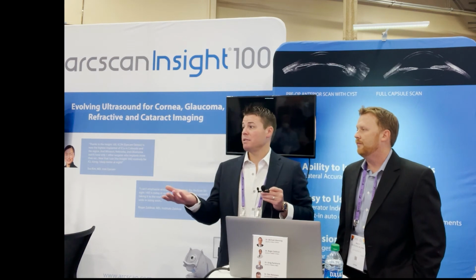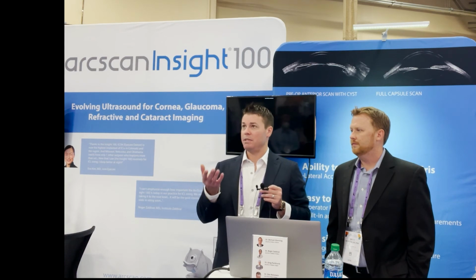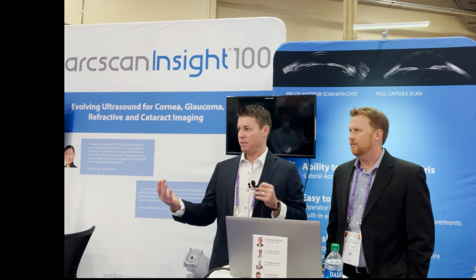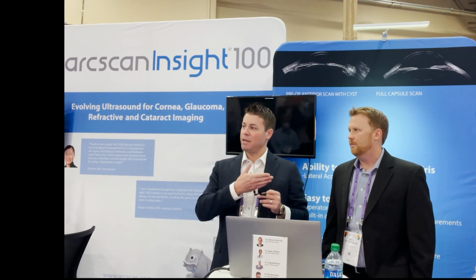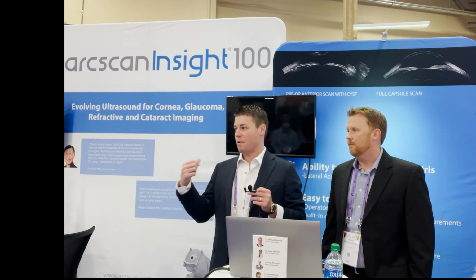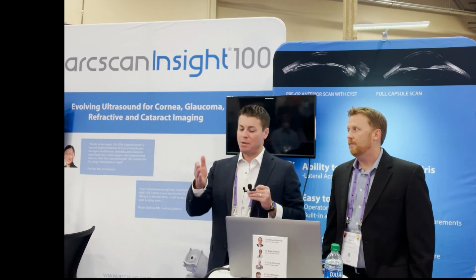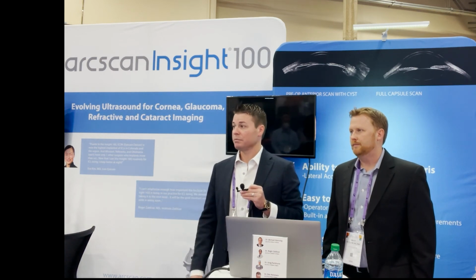Well, that didn't exist. Before Dan Reinstein's nomogram, there was no such thing as a table that said if you use this size lens, your vault should be X. We had nomograms that said if you want to avoid outliers, then use this size at this sulcus to sulcus measurement. So he's not saying that the vaults are plus or minus 300, they're plus or minus 300 of predicted based on the nomogram. So for example, if it predicts that our vault with a 13.2 lens is going to be 600 microns, it's going to be within 300 and 900 97% of the time, which is a happy zone.